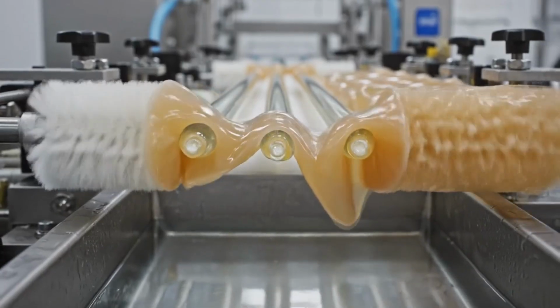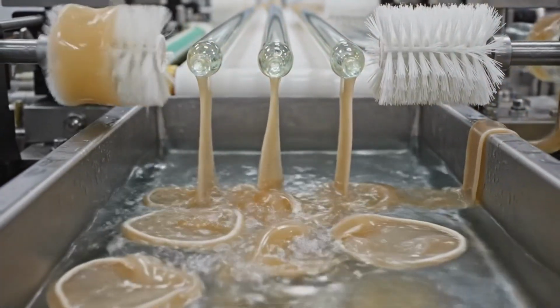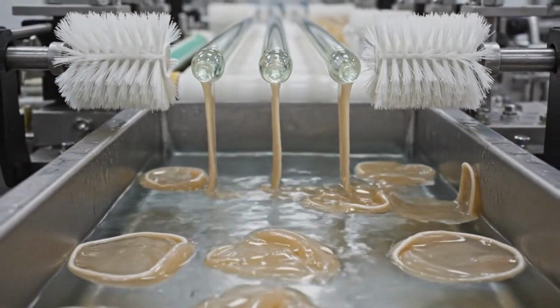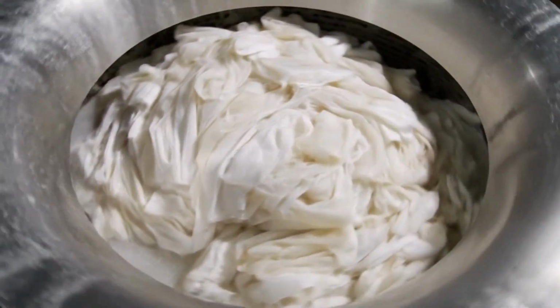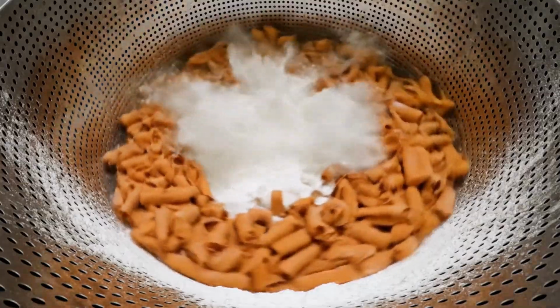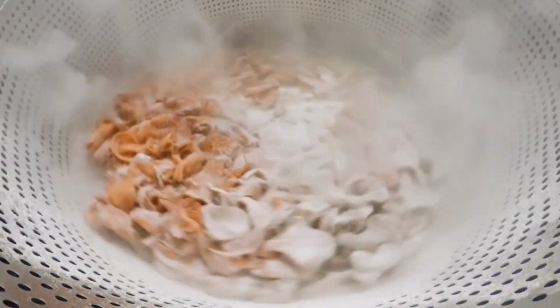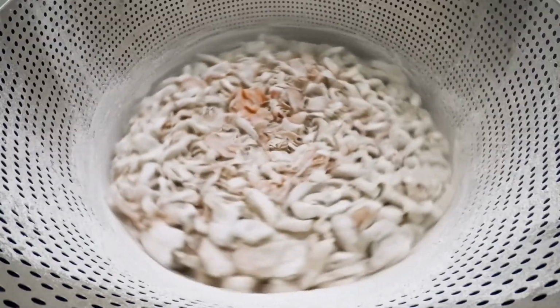After a journey of nearly an hour, the condom is finally a finished physical object, freed from its mold. We must remove the water quickly to prepare the rubber for the final drying and powdering stage. Without this powder, the rubber would bond to itself, making the condom impossible to unroll.